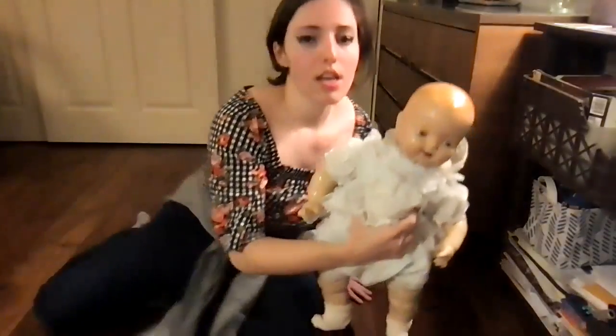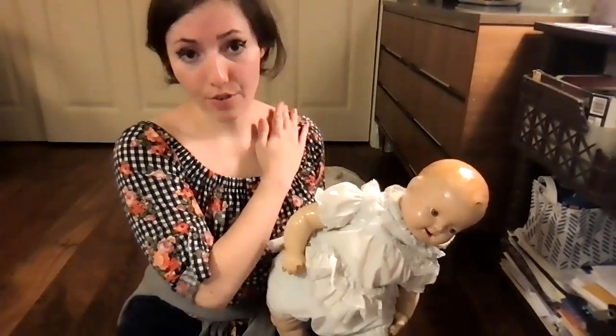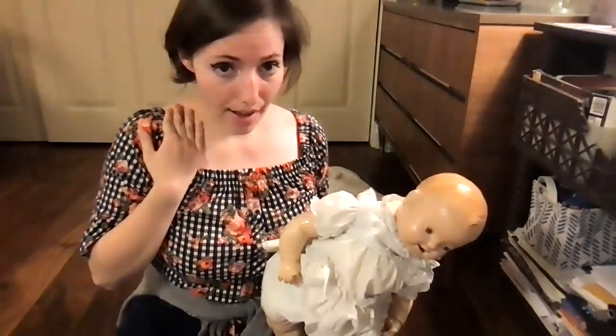I don't know if you can see this on the right side. This is mirrored. This is my left, but you see it as my right. So imagine, you're going to be placing the pad on the right side of your upper chest. That's where the first pad goes. Right side on your upper chest, you're going to place your pad.